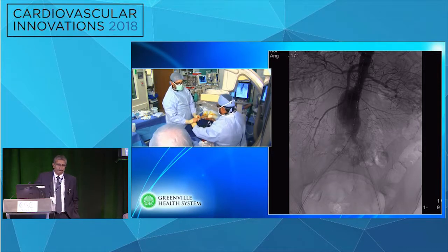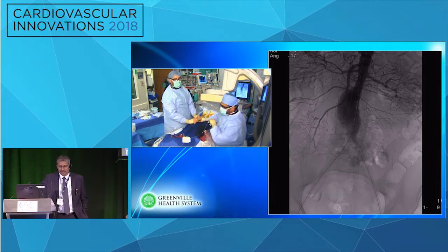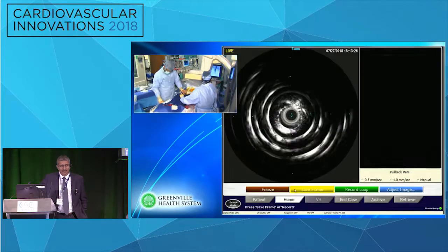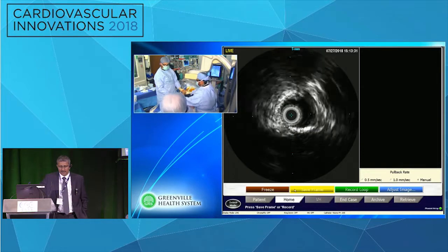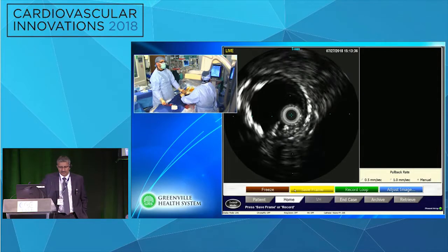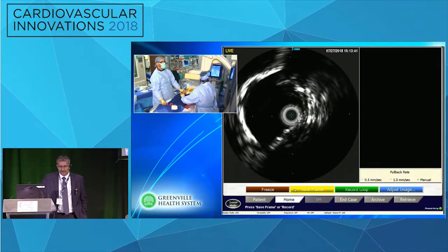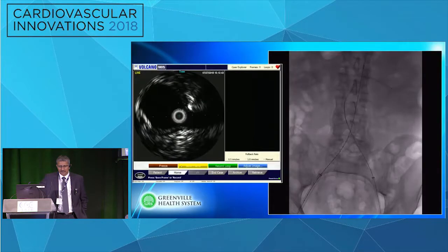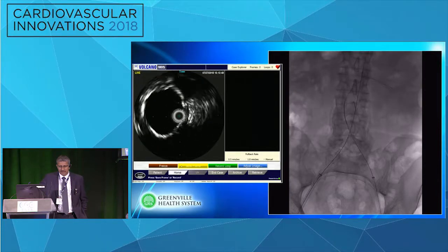And so what we'll do here is, can we show the IVUS catheter as well, or the IVUS feed? All right, come on, live. All right, we're going to send our IVUS up. Pin wire, please. So here we are in our proximal aortic neck. Heavy calcifications. You can go up a little bit and you see your renals come off. Our right renal there, coming down a little bit, and you'll see your left renal right there. That's left.